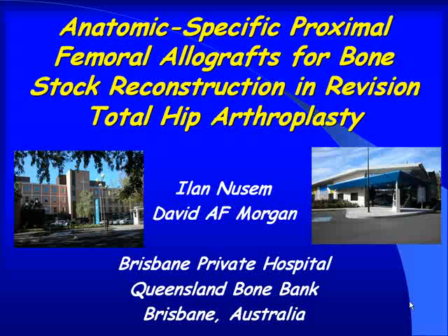In all septic cases, the operation was performed for infection. The procedure was staged.